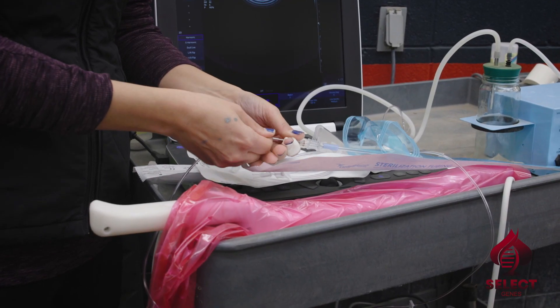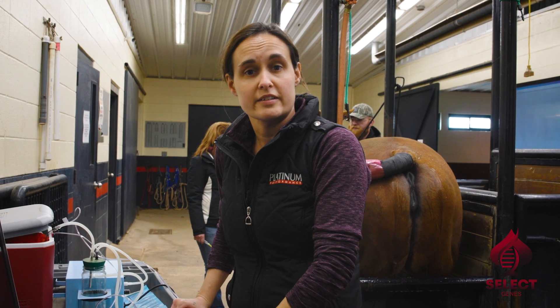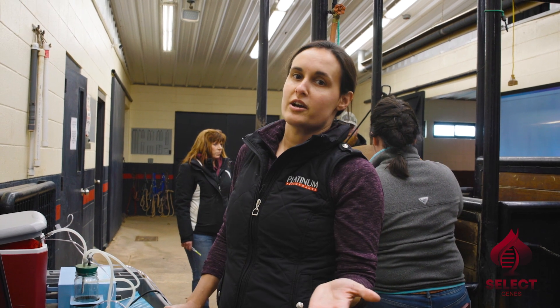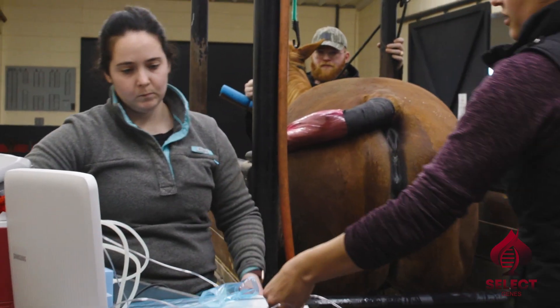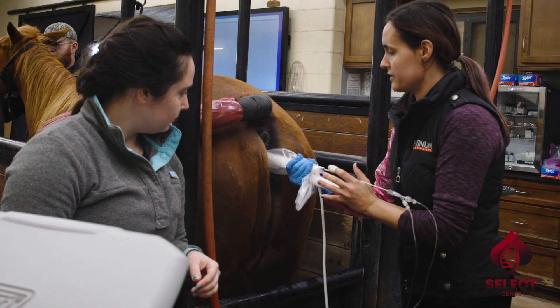What we're going to do to this mare is we're going to aspirate her oocytes, which are her eggs, directly from her ovaries and send them to a lab to get fertilized. That fertilization process we call ICSI, which stands for Intracytoplasmic Sperm Injection. That's just the fancy term for the way that we fertilize the egg in veterinary medicine, in horses specifically.